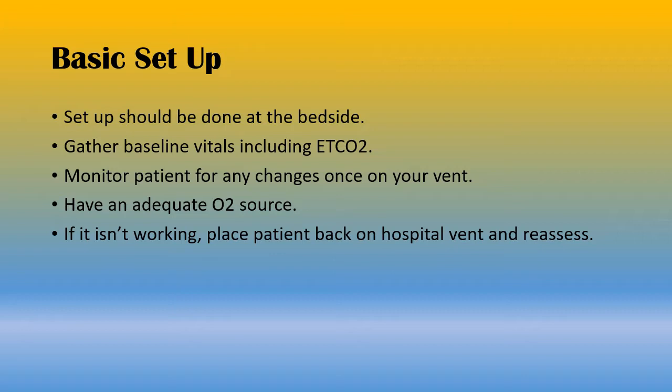When we put them on our ventilator, we want to make sure they're still doing well. When you change them over to your ventilator, make sure that the vitals stay within the same range. If it happens to not work, place the patient back on the hospital ventilator. That's why we do it at the bedside, because if our stuff fails or it doesn't work or the patient doesn't like it, we can put them right back on the hospital ventilator and they can go back to ventilating the way they were, which in theory was keeping that patient in a good stable state.